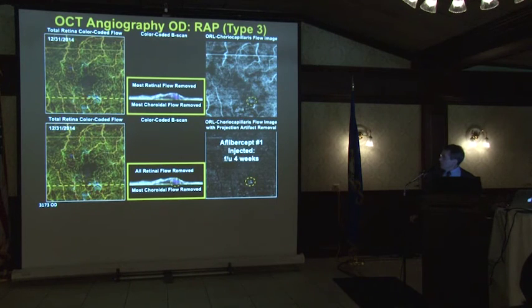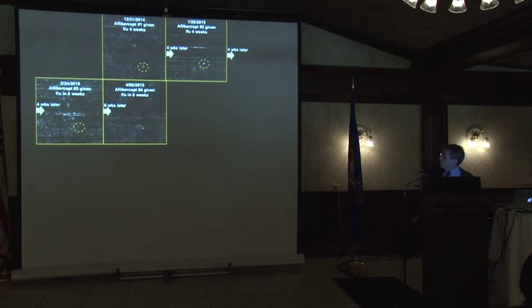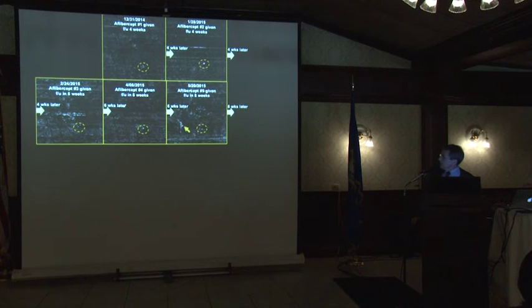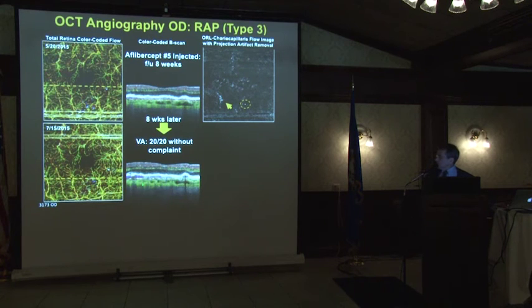Okay, injected with Eylea. Let's see what happens. 4 weeks, comes back 6 weeks later, comes back 6 weeks later, and now we extend to 8 weeks because the patient's doing so well on structural OCT. Okay, comes in 8 weeks later. Notice the flow here. It's different under the RPE. Okay, there was something cooking back here that was different than what was here.